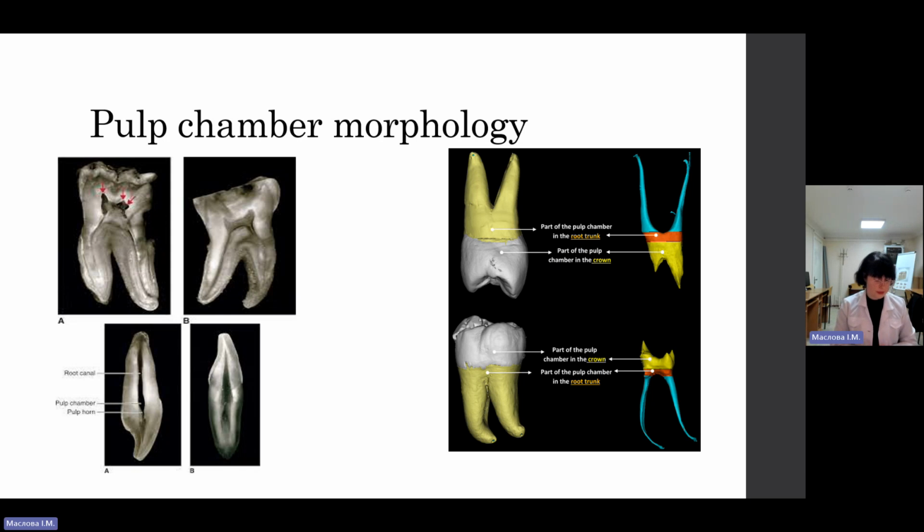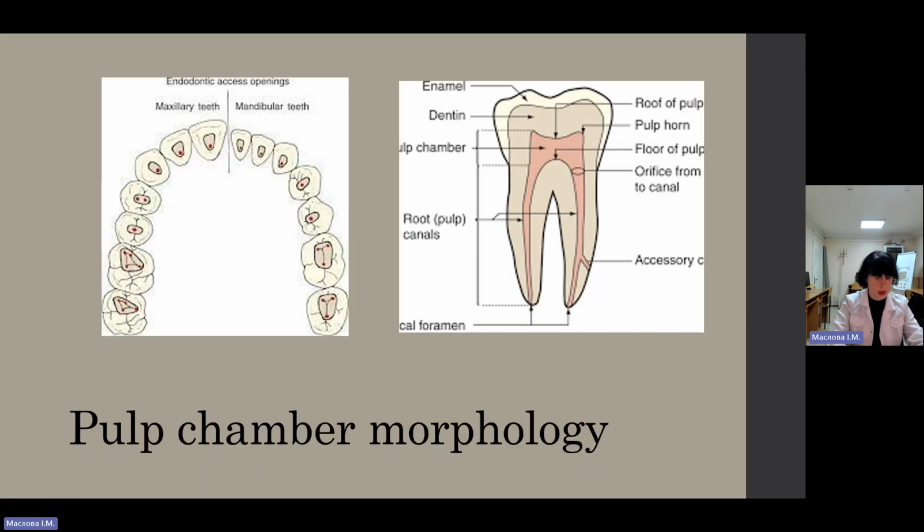Premolar teeth. The maxillary first premolar in most individuals contains two canals and is extended more buccolingually than single-rooted premolars. Approximately 5% may have a third root canal placed buccally. In such a situation, the access will be triangular in outline with the base toward the buccal side. You can see all that I say on the slide with maxillary and mandibular teeth.